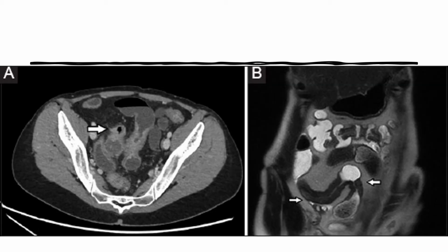On this next slide of images, these are some images taken from Crohn's patients. Here, these levels are a little lower, as you can see by orienting yourself: this is kind of the center line of the os coxa, and we have the sacrum here. So you have the sacroiliac junction. Behind the os coxa, you have the gluteus maximus, medius, and even minimus. So you can tell what level you're at with that.